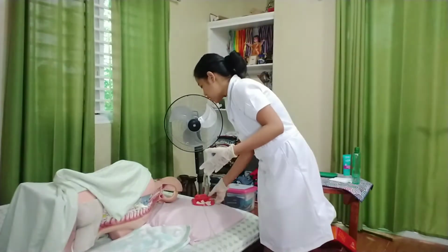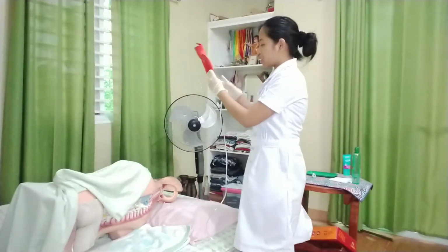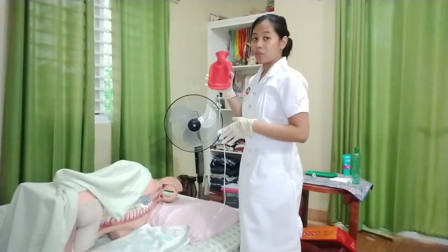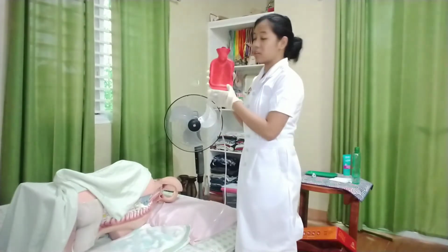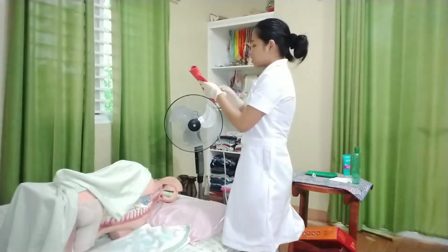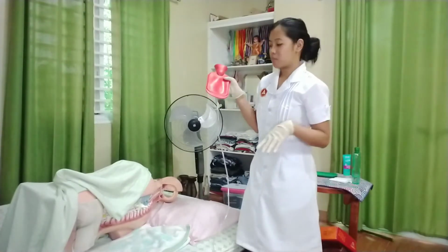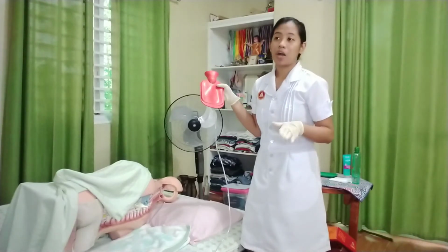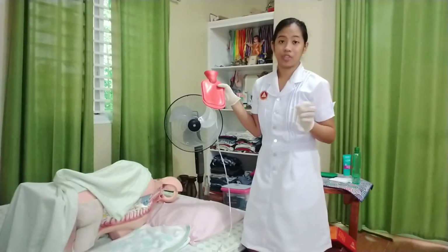So assuming that this is the solution container, I will hang or hold it above the rectal area, and then I will open the clamp to allow fluid flow, and I can also compress it if we are using a compressible container. So in administering enema, for low enemas, usually the solution container is hung or held about 12 inches above the rectum, and for high enemas, it is 18 inches above the rectum.